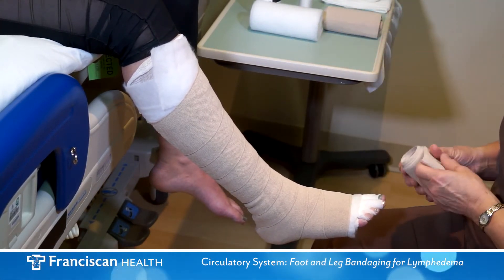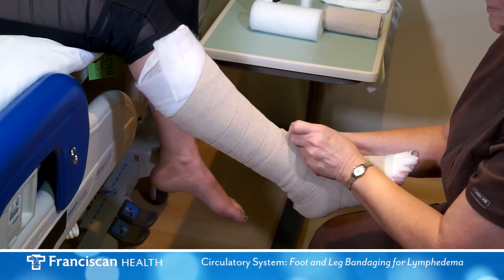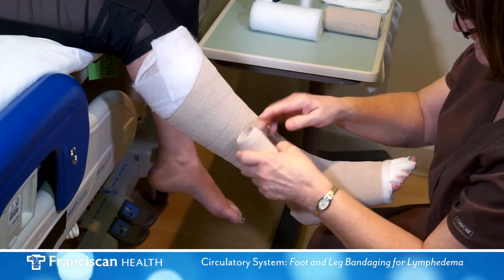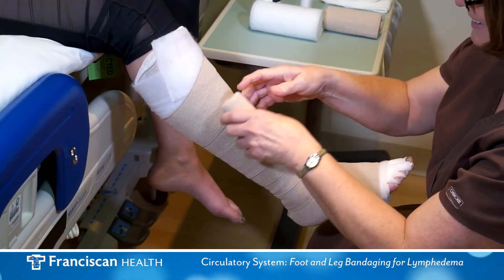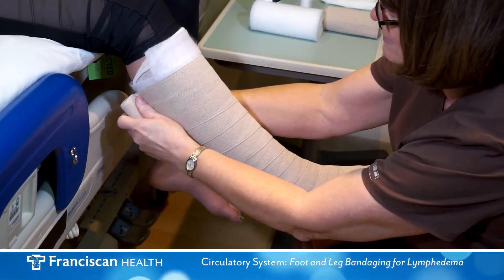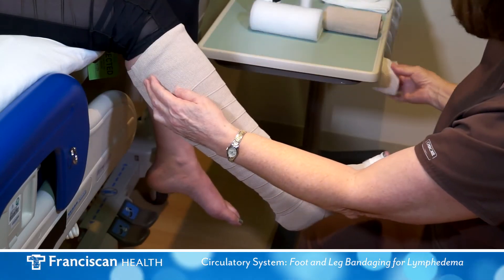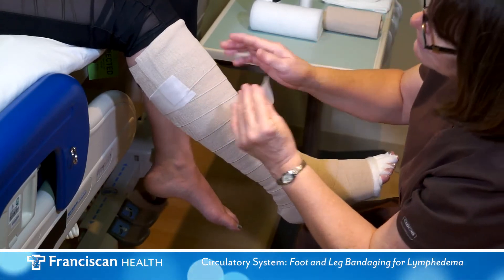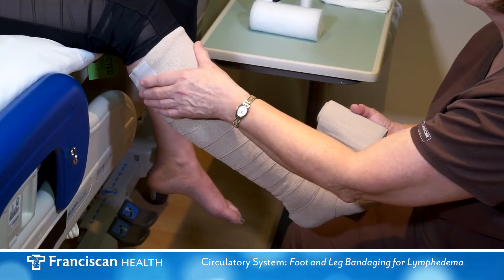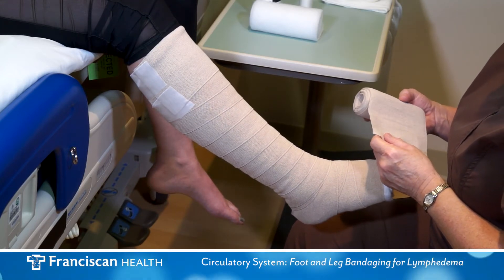The third compression bandage is the next largest. Begin at the ankle in the opposite direction in a spiral fashion, ending just below the knee. A fourth layer — the largest of the bandages — can also be applied, starting at the ankle and ending just below the knee.